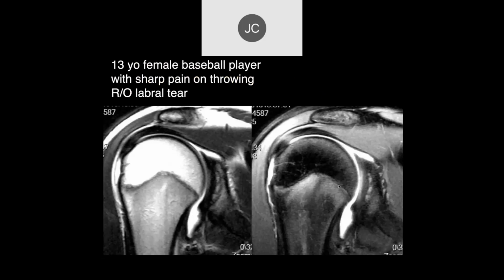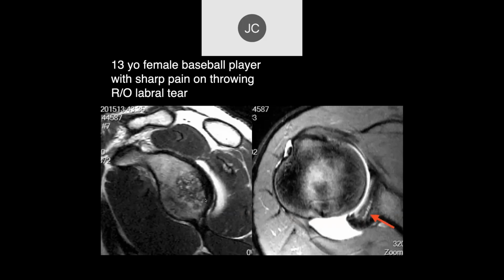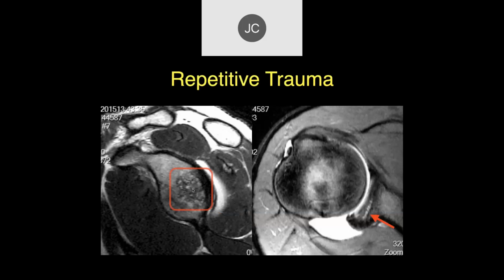13-year-old female baseball player with sharp pain on throwing, rule out labral tear. That inferior labrum looks kind of irregular. There's a little bit of like scalloping there. This is probably the end of the labrum. Maybe there's a little irregularity of the inferior glenohumeral ligament here. So there's some subchondral like cystic changes. And so it's probably some glenoid impaction injury. Here you can see the irregularity of that subchondral bone. And this is again another glenoid injury from repetitive trauma.